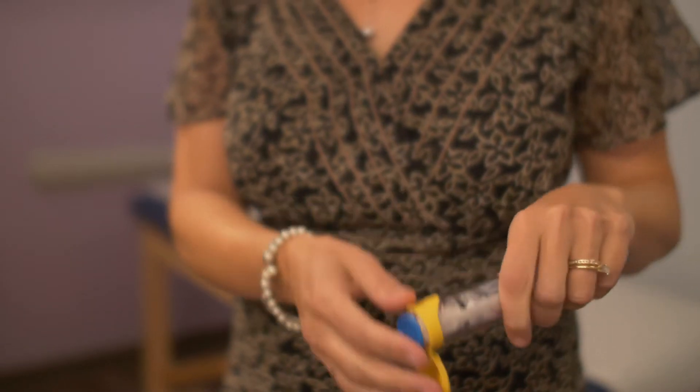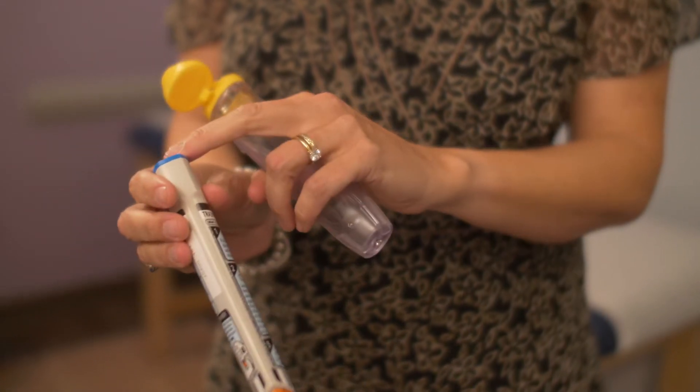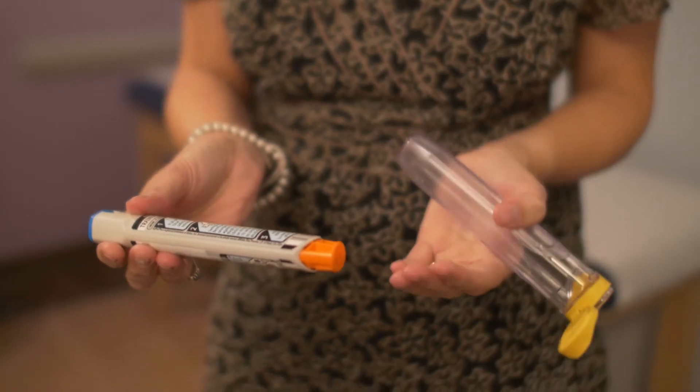You'll take off the top and simply slide it out. The blue end is the safety cap and the orange end is the needle. Think: blue to the sky, orange to the thigh.